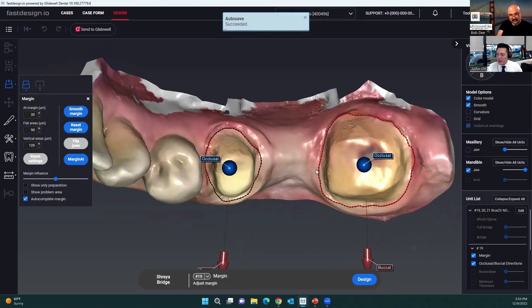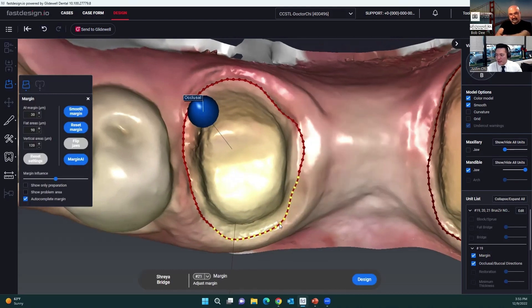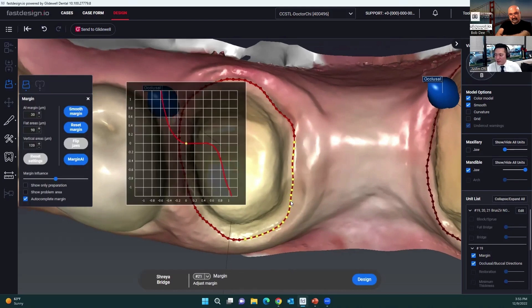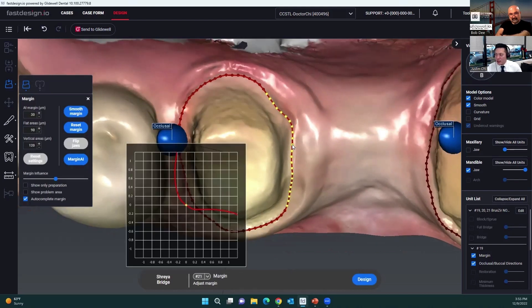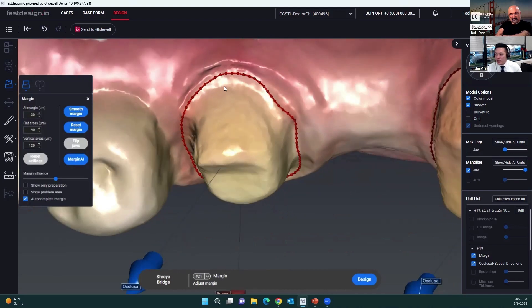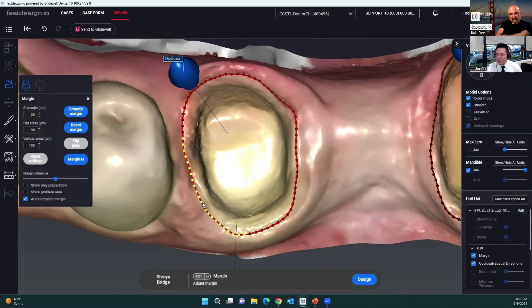The margin AI starts out by establishing the margins, or pre-placing the margins. I actually didn't do a great job of retraction here, but using the color mode and since I prepped it, I have a pretty good idea of where to position that margin line.